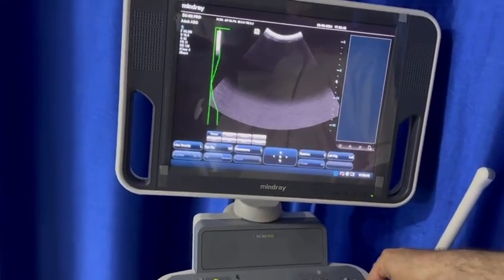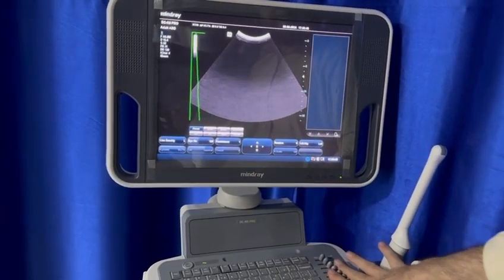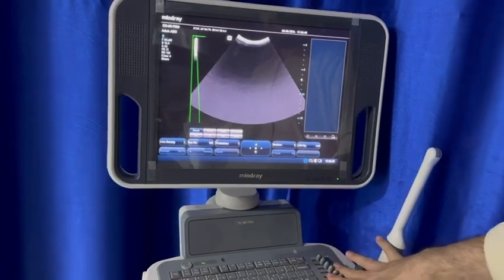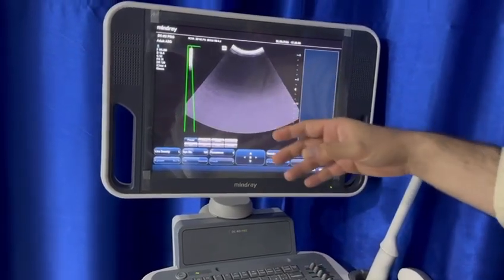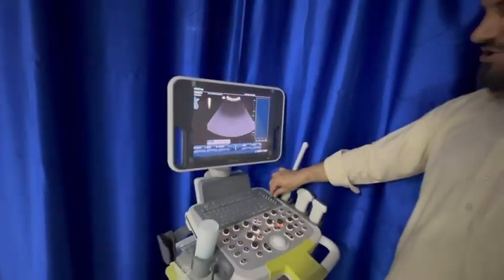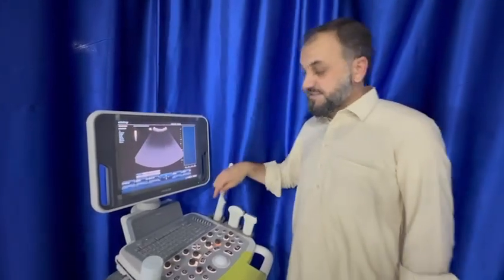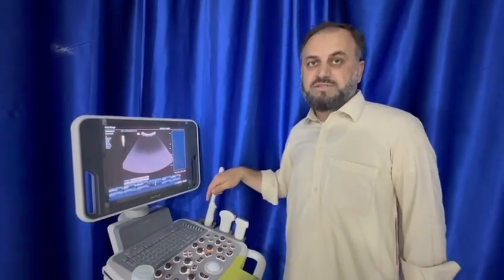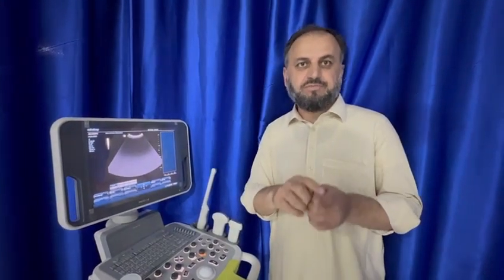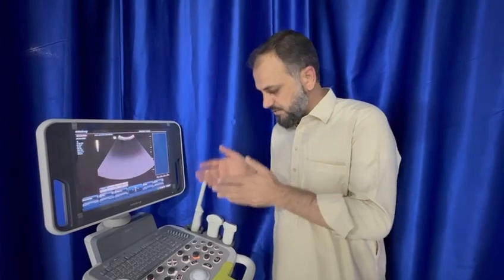Sometimes we want a clean image — for example, if you're looking for a vessel or something — so you change only the specific TGC, time gain compensation. That's the difference between them: sometimes we need the 2D gain, sometimes we need the TGC. Take care.